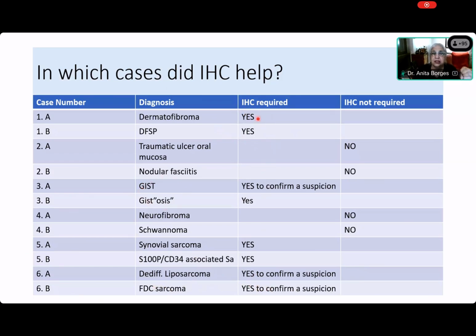And you can be faulted for not doing immunohistochemistry to make a diagnosis of dermatofibrosarcoma protuberans if it is a small lesion, and you could mistake it for a dermatofibroma. This you need immunohistochemistry for, and for a gastrointestinal stromal tumor, you cannot do without immunohistochemistry. You do need to confirm that. Okay, so that's the end of my talk.